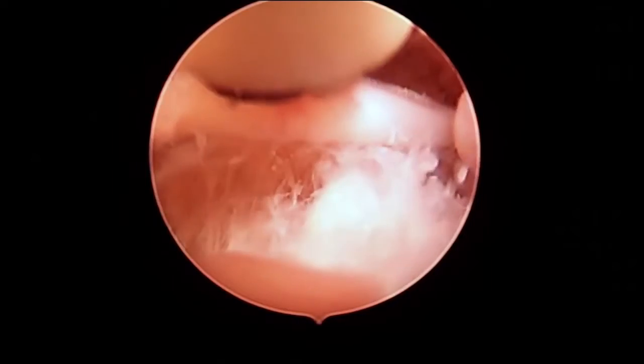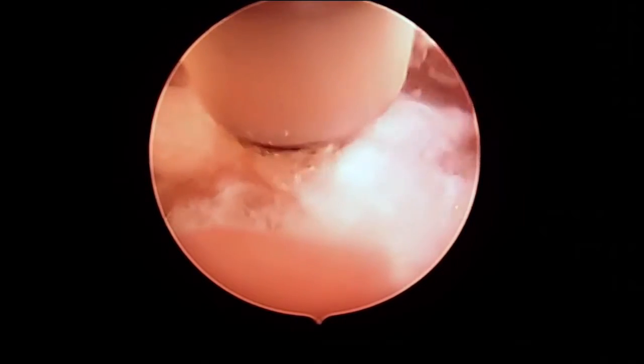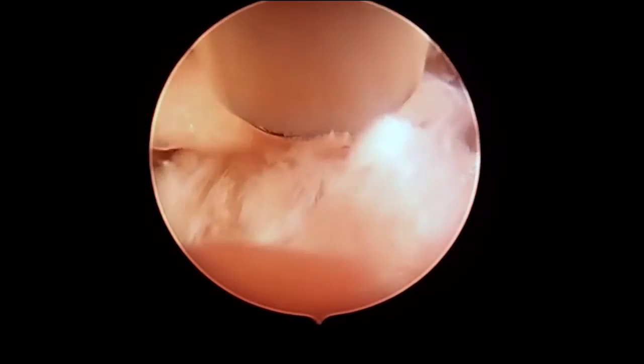We're ready to take a permanent step in relieving that pain called direct visualized rhizotomy. This is about a 30-minute procedure. You can be asleep or sedated for the procedure. We go in with a scope to the same nerves that we numbed up in the medial branch block, and now we cut them.